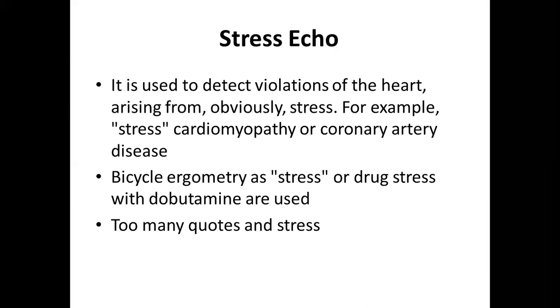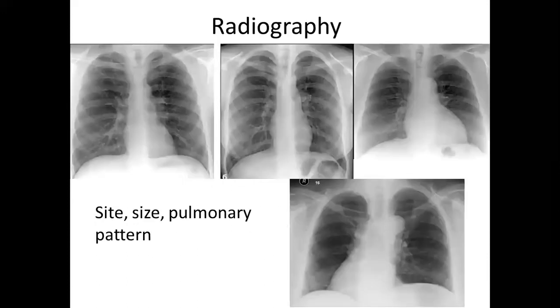Other option is stress echocardiography. As you understand, we are applying some additional loading onto the patient, and it may be either physical or medical, like drug-induced stress. So what is the point here? The point is that we can check the images of ischemia, like latent ischemia, which appears only when you have some stress.